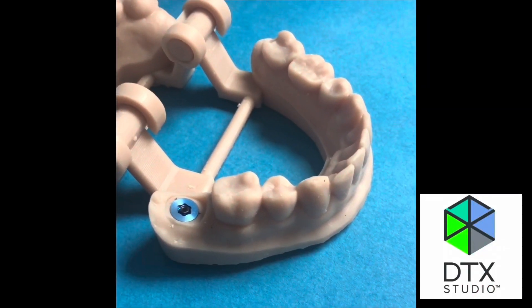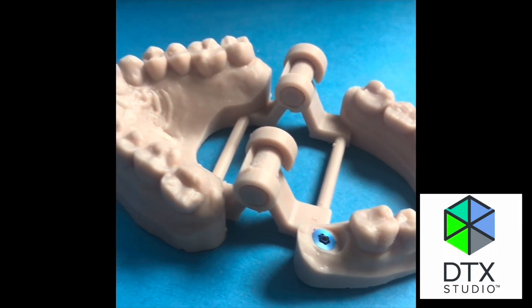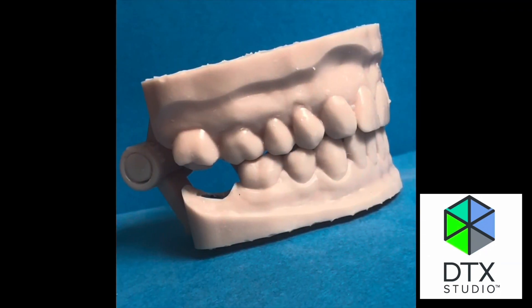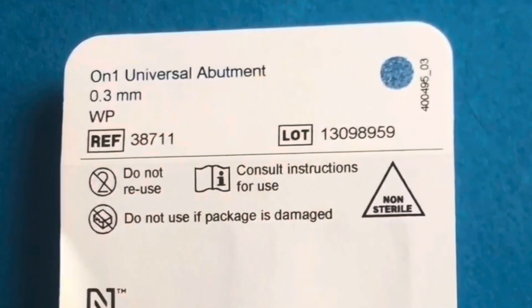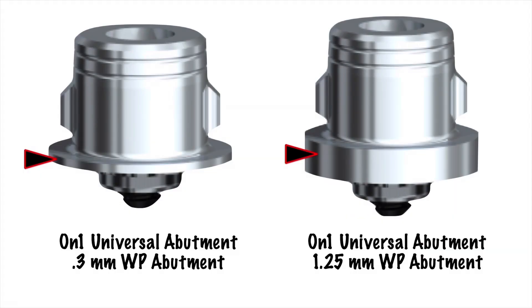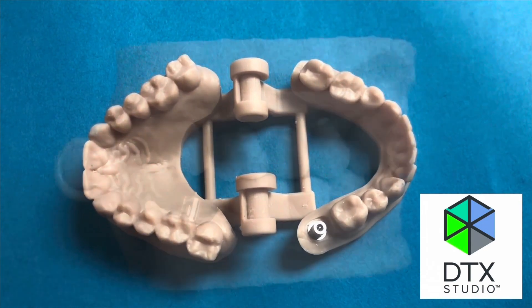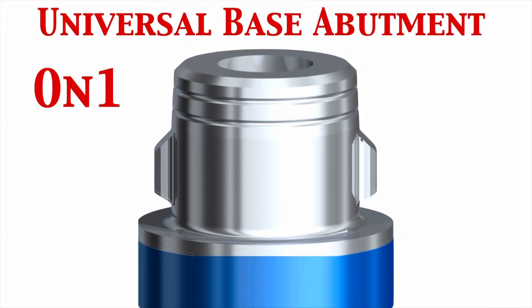Now we have everything needed to fabricate the crown. We have this printed model that's articulated based on the hinge printed with the model, and we can look at how much height we have. We'll open the titanium on1 universal abutment and screw it down on top of the replica we just placed into the model. This is an on1 universal abutment point three — my favorite — and it gets screwed down on top before we start fabricating a zirconia crown.